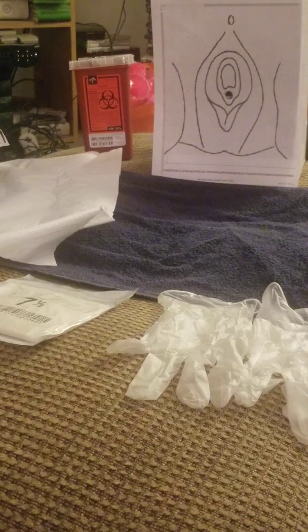Now, the next step is where I would be opening the sterilization tray. Once I open the tray using sterile technique, I will don my sterile gloves, and then ask the patient to lift her buttocks so I can slide the sterile drape underneath her with my gloves protected by the cuff. I would then go in my kit and place a sterile drape over her perineal area where it's just exposing the labia. I don't need all of her to be exposed, just what I need exposed.